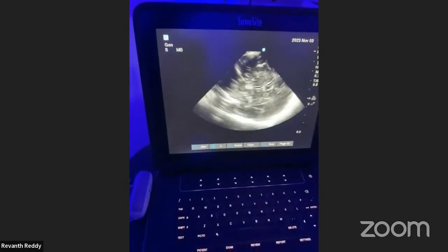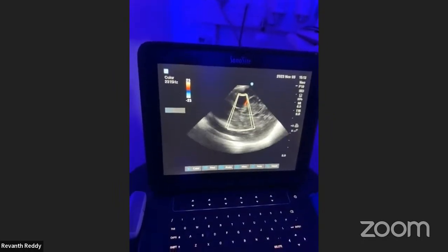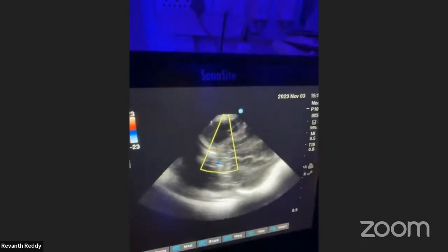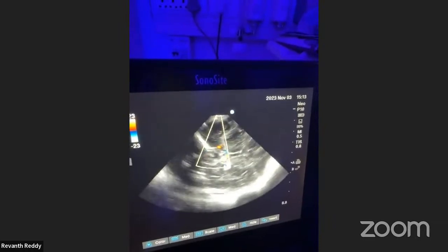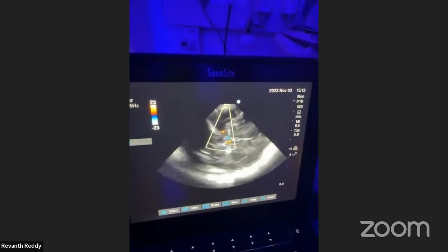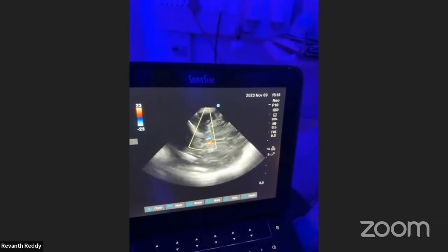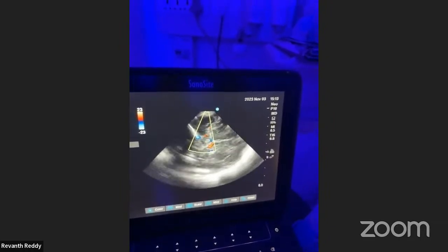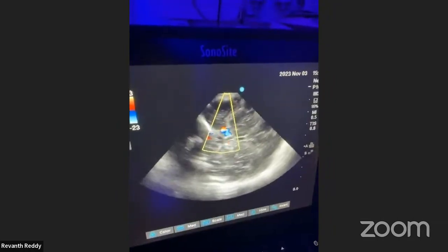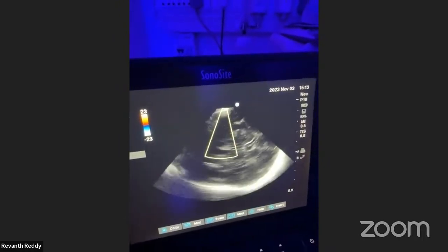Baby is a bit agitated. This is the midbrain, and so you can be able to see the circle of Willis. So you can see some arterial and venous flows over here. That will be the circle of Willis near the midbrain. So here you can see. If you are finding some vein of Galen malformation or something, we can see it through this temporal view.